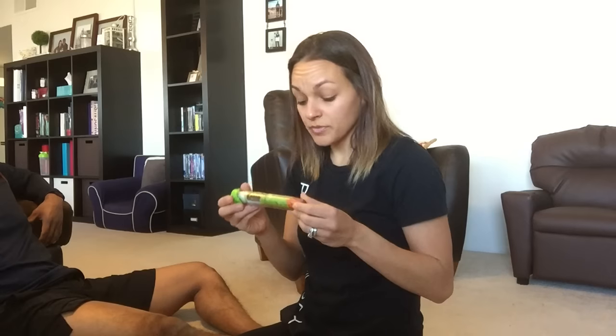Our son Leo has several severe food allergies, so we have to carry an EpiPen and Benadryl everywhere we go. We've never had to give him an EpiPen, but recently his EpiPens expired and we got a new set. This is one of his old EpiPens — it just expired about a week ago. We talked to the allergist about my husband injecting it into his leg so he could see what the epinephrine feels like, so we know exactly what we're doing.